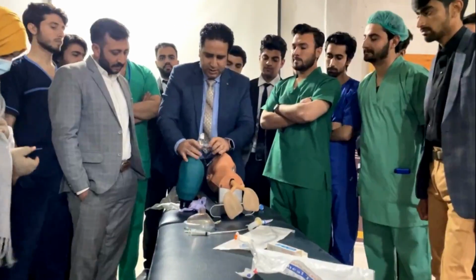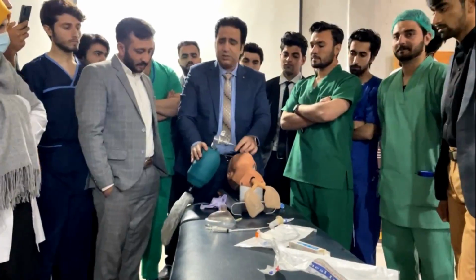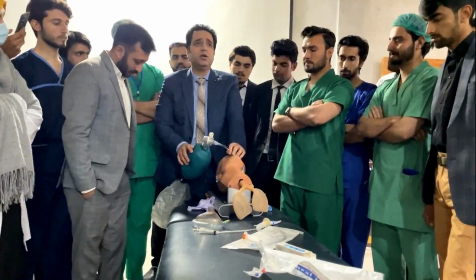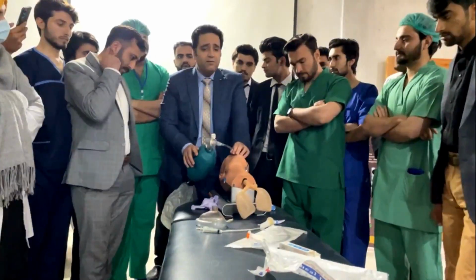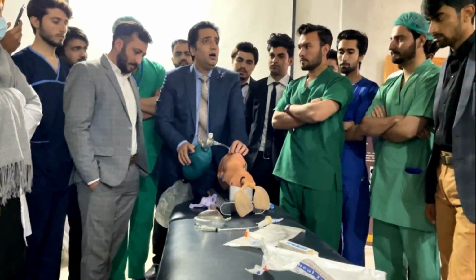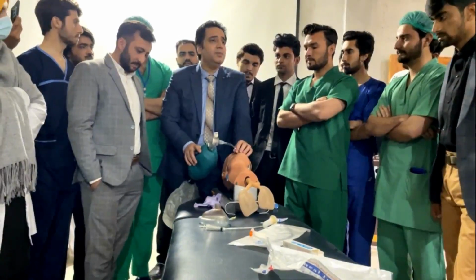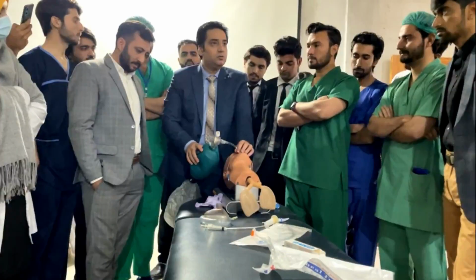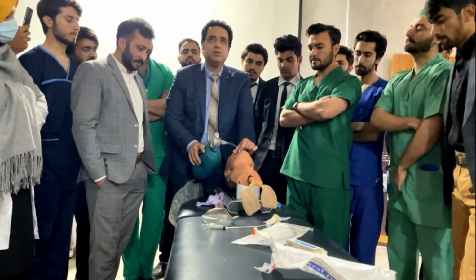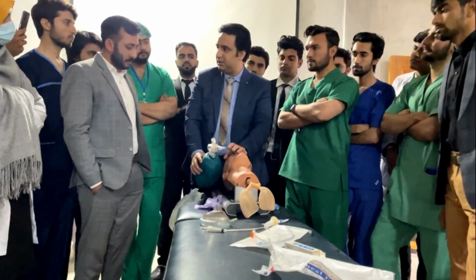So now you have done an intubation. You can give air, and you can secure your line. If the patient has come for surgery, you can operate. But whenever you want to extubate a patient after such a difficult intubation, it should be done under a very senior consultant, and maybe the patient should be brought to the ICU along with the tube, and the extubation done under supervision of a senior, not some haphazard extubation.